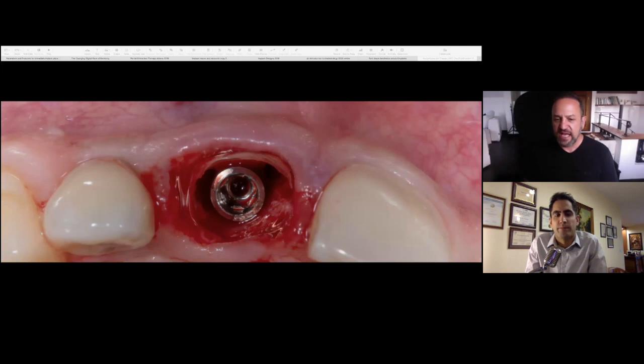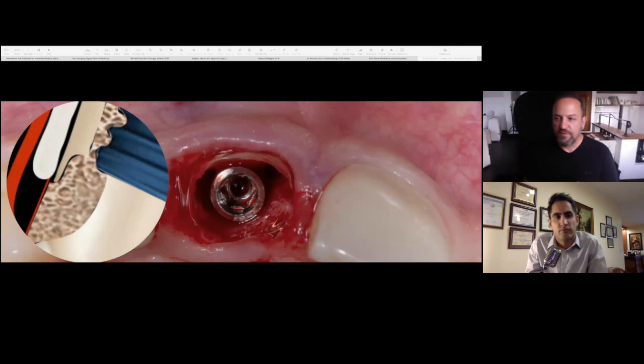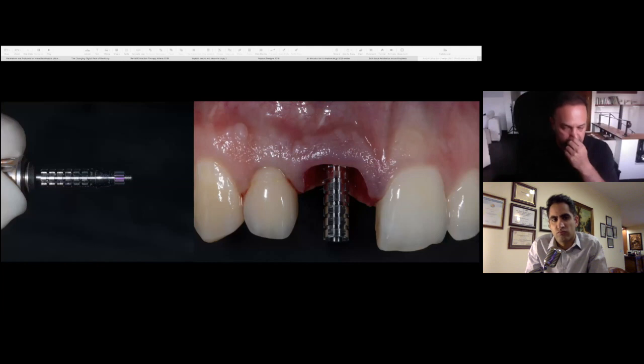Placing our implant away from the shield, placing our implant 0.5 millimeters above, so you can see from the animation that we've got there, you can see the level of the shield to the bone. You can see the chamfer that's 2 millimeters from the bone level, and you can see now that this portion is just 0.5 millimeters above the base of the chamfer, to create the prosthetic space. Okay, and that certainly in all our prospective data now has shown that we can almost eliminate that completely.